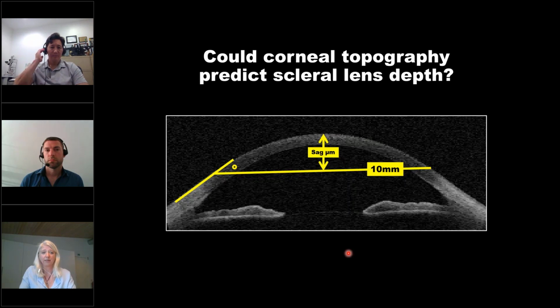I certainly do, and I use it as shown in the slide, that we measure the height in 10 millimeters, and then we can add up to the diameter where we know that this scleral lens we want to fit is landing. So this will give us a very, very good idea of which trial lens we will begin with, and very often it's very accurate.